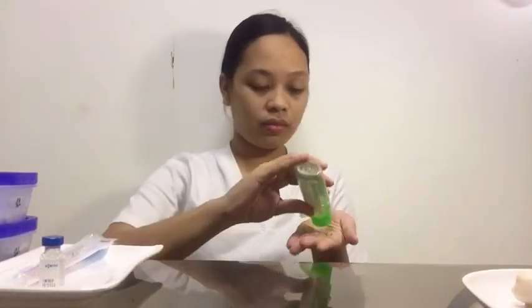Next, we're going to perform hand hygiene. Then, prepare the medication from the vial for drug withdrawal.